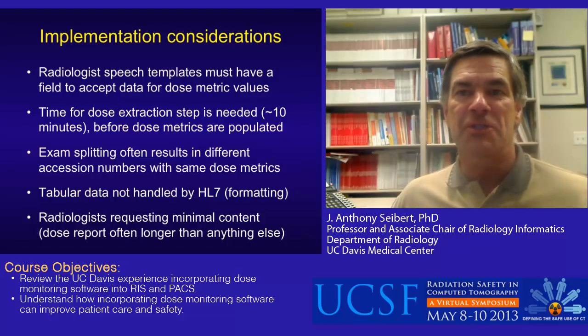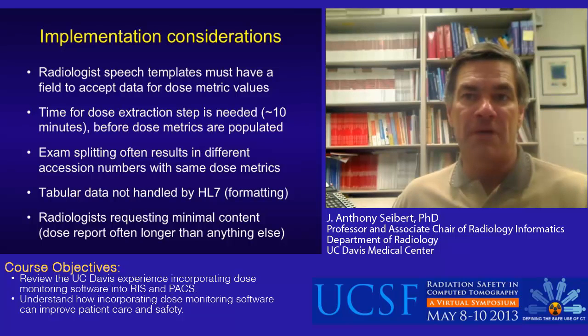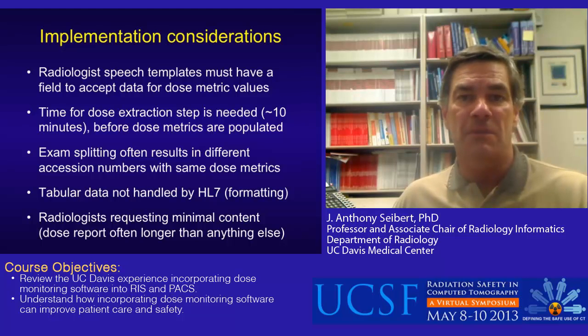Implementation considerations include the following. The radiologist speech template must be modified to accept radiation dose data. Dose extraction and delivery requires a minimum of on the order of 10 minutes or longer, sometimes longer than the radiologist is willing to wait, particularly in life-critical situations such as trauma exams.